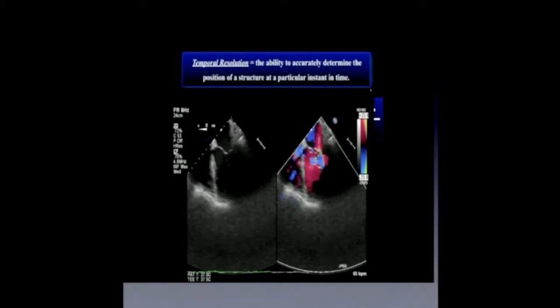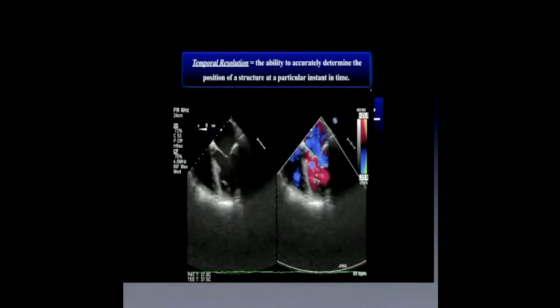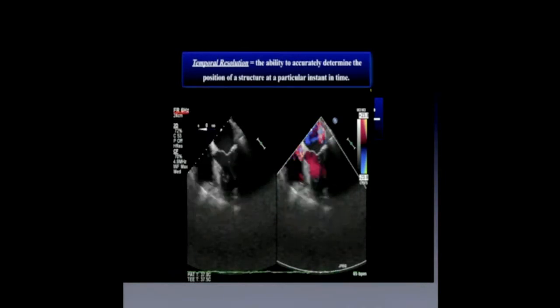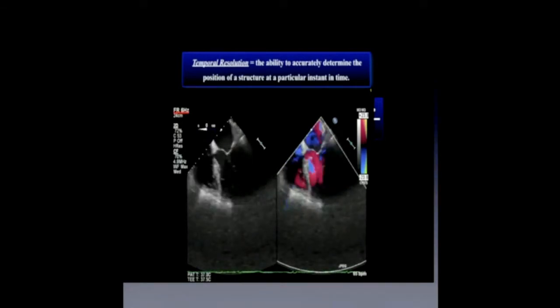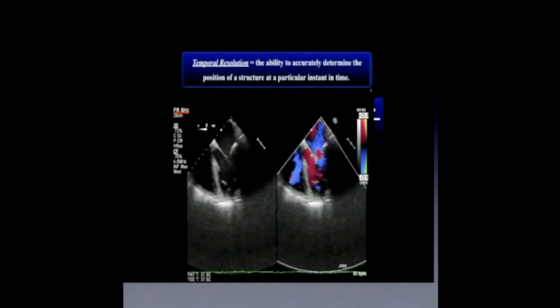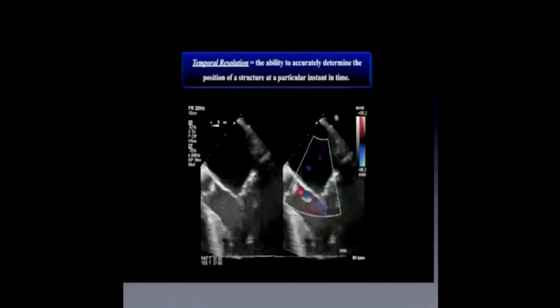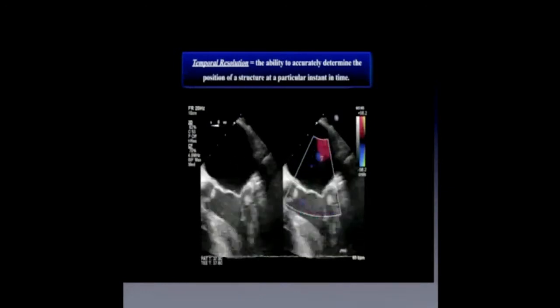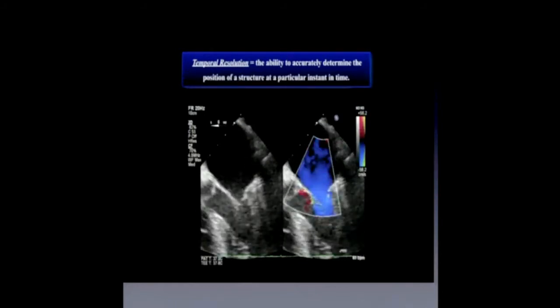So this is a video that I stole from the PTE Masters website, and what it does is tries to demonstrate a reduced frame rate. So you can see there's a lot of extraneous space that we set the imaging depth very deep, and therefore the frame rate up here says 6 hertz, okay? And that's because we're having to scan all this wasted space out here, we're telling the computer that there's information there. And now what they've done is they've set the imaging depth lower, and they've been able to increase the frame rate. You see it's less choppy, and it says it's 20 hertz here. The frame rate's a little faster.